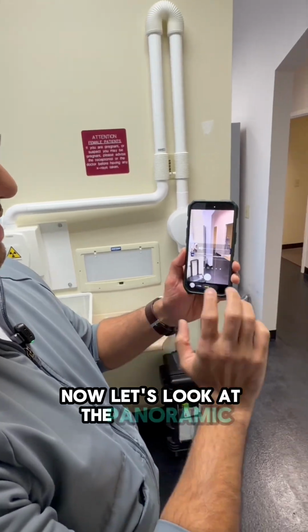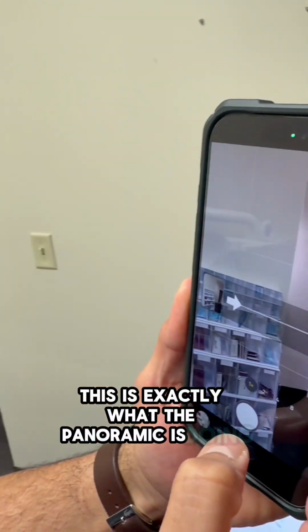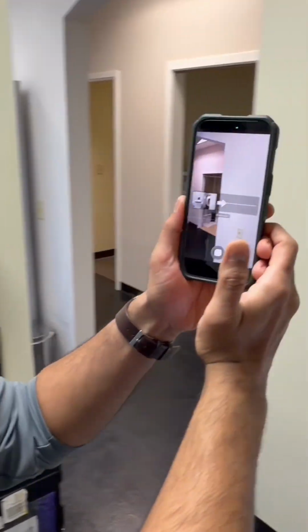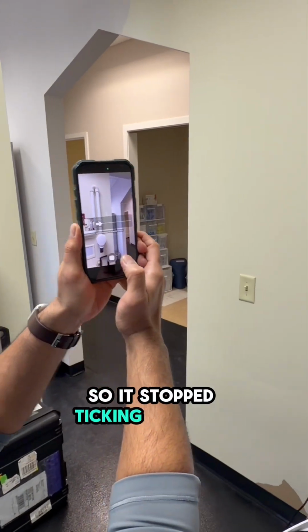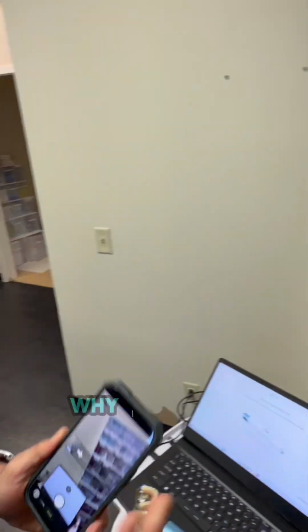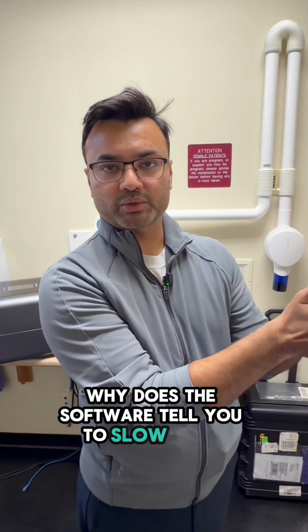Now let's look at the panoramic picture again. So when I start, this is exactly what the panoramic is doing, and the problem is it says immediately slow down, so it stopped taking. Let's go fast, slow down. Why does it say slow down? This is the most important part. Why does the software tell you to slow down?